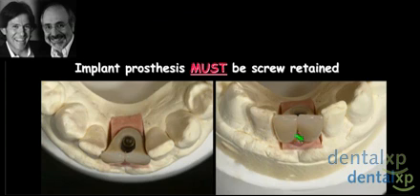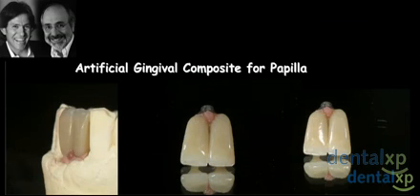Oh, there it is. You can see where we've actually allowed us to build the papilla where there was no problem with screw access. So it's really given us the prosthetic ability to do these things. Now you can add that tiny little piece of papilla. The interface is going to be flattened, as we talked about. We don't even do ovate pontics in these. We try to get flat surfaces all around that are cleansable.